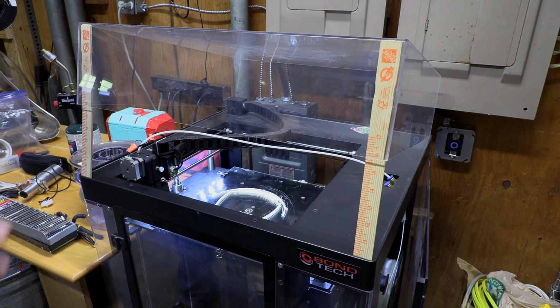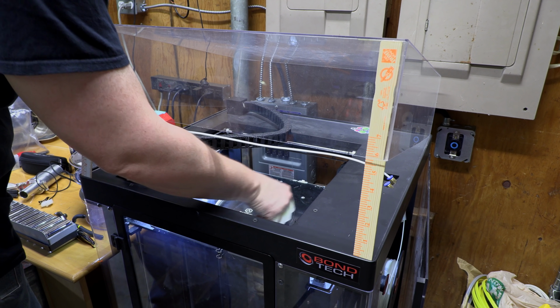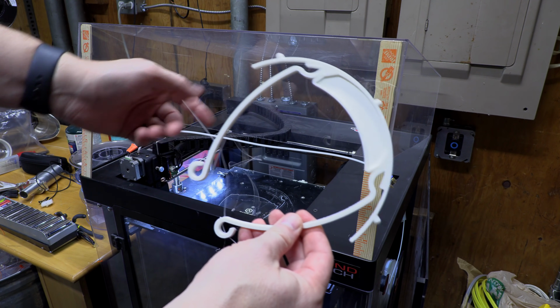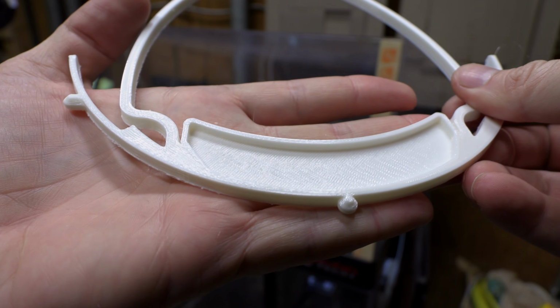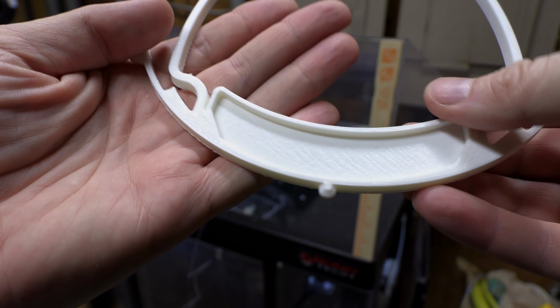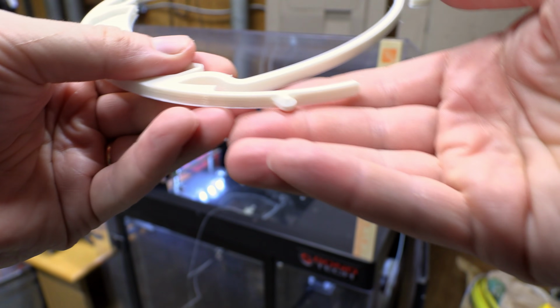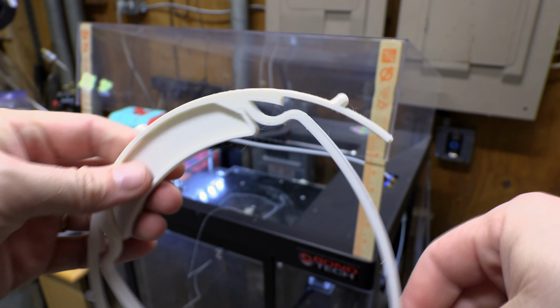We're at the N2 Plus. Let's see, this has the VisionMiner nanopolymer adhesive on it, and it's just Creality PLA. So it comes off really easy. That's not too bad. It's still got a bit of a skirt stuck to it. Well, that's not too bad. It looks like I'm still having leveling pains with the N2 Plus and that piece of glass on there. You can tell the bits right there. That little edge, it's a little too close to the build plate, where that edge looks really, really good. But the rest of it looks fine.